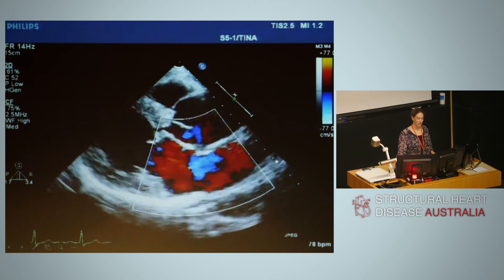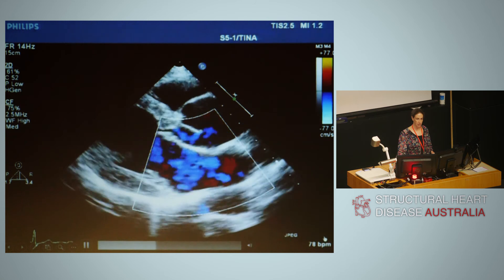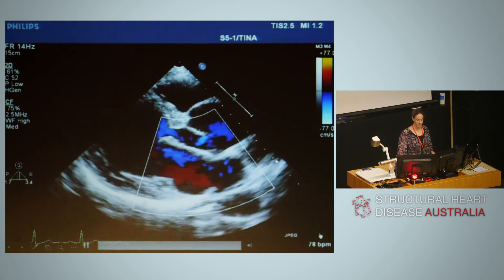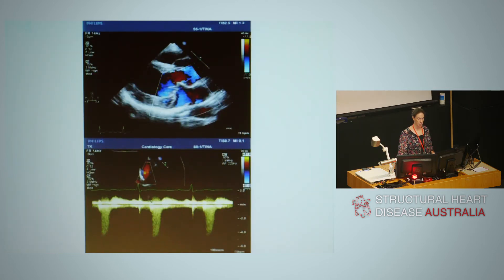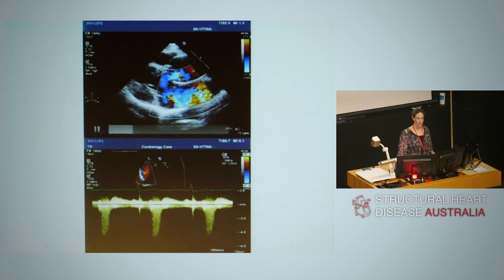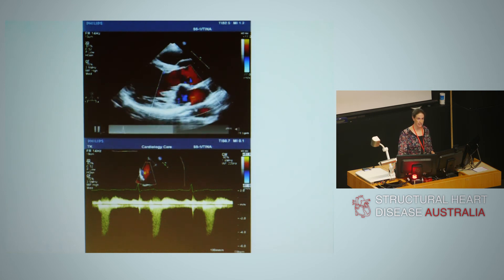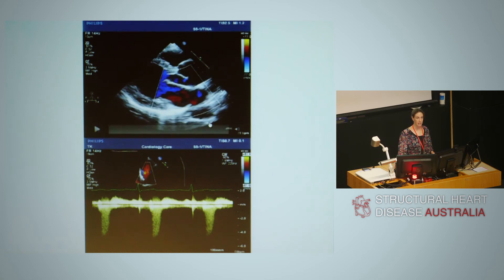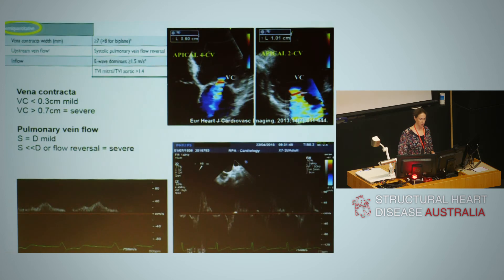Returning to the bileaflet myxomatous prolapse image with a lot of mitral regurgitation — how severe is this? Be very careful about timing. The Doppler signal shows the regurgitation is only in the last half of systole, so whatever we think the regurgitation is, it's probably only half of that — we must correct for the duration of regurgitation in systole. Supporting this, the left atrium is not dilated and the E-velocity is not particularly high. It's not just the size of the colour jet, but the timing as well.